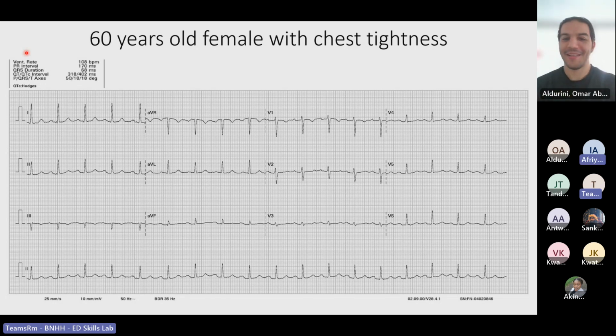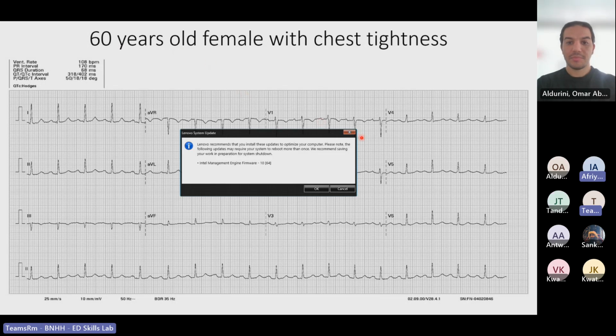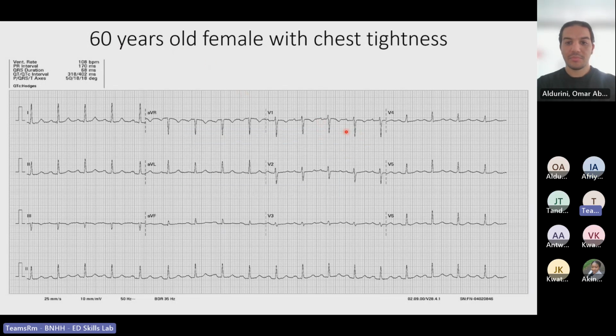Yeah, I can try. We are all beginners. As you said initially, I need to check the presentation of the patient and then the ECG itself. So let's assume that the patient's complaint sounds more cardiac or suggestive of ischemia, so you go ahead and do the ECG.